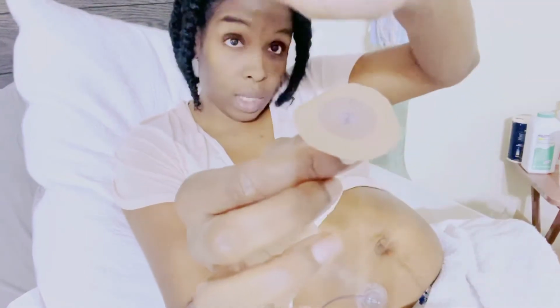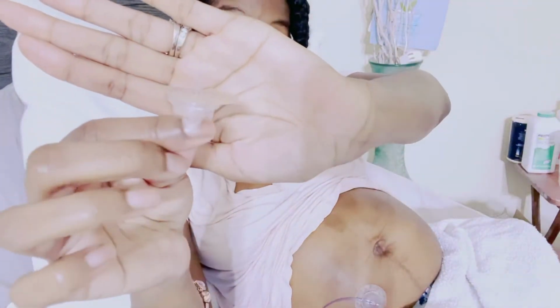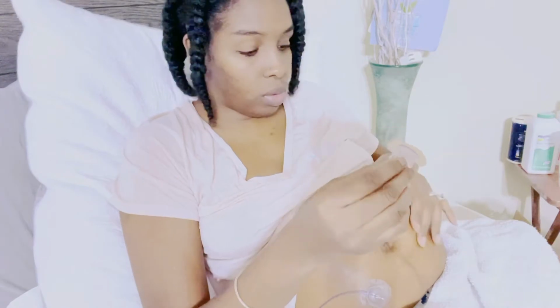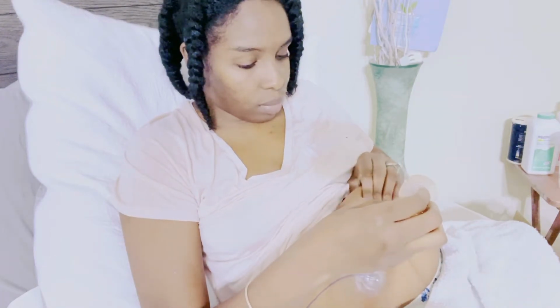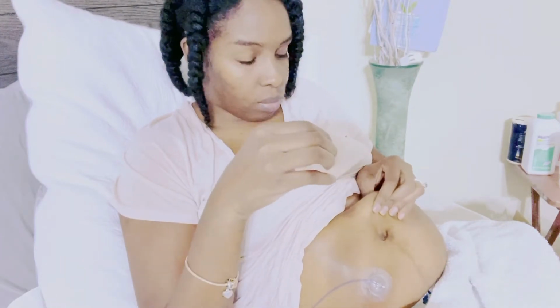I don't know what they talk about when they say this needle does not hurt. That needle freaking hurts, okay? So if I'm a little squeamish, y'all bear with me. So you gotta pinch your skin really, really tight, so that it doesn't hurt as bad.